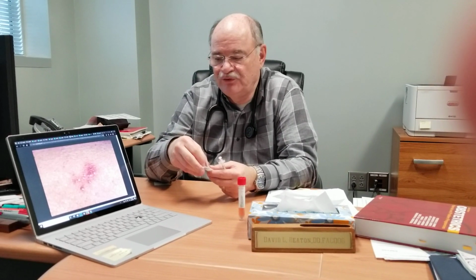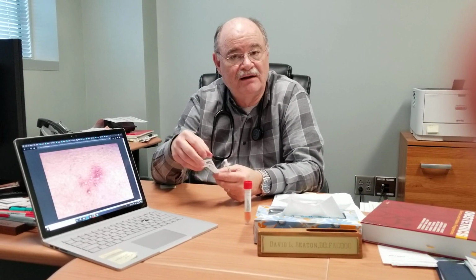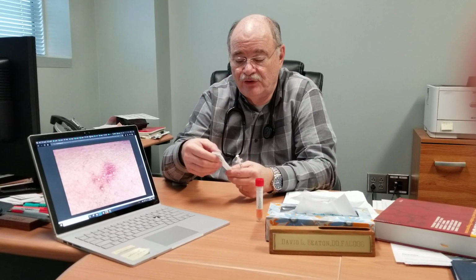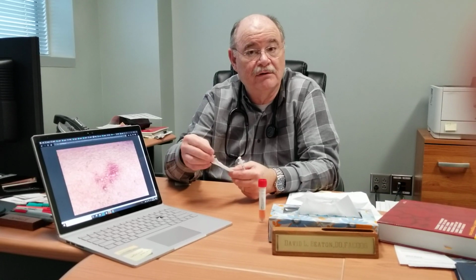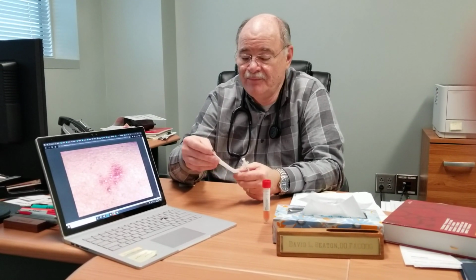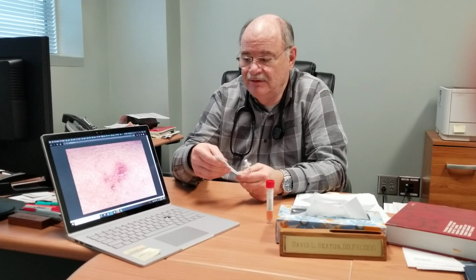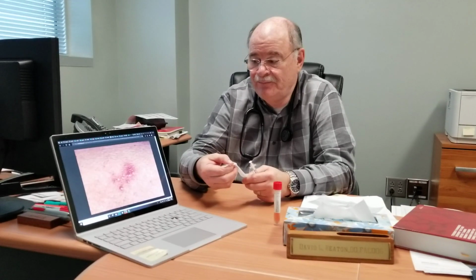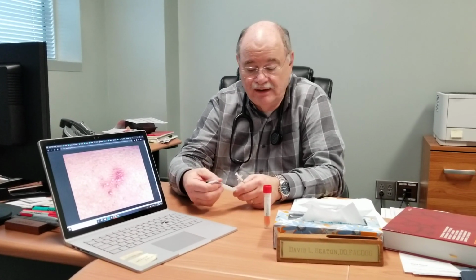I find that most patients find that very uncomfortable because the vesicles are quite sensitive and it's tender around them. So you're lucky if they don't kick you or bite you or not like you anymore. I have a different technique to get the sample, and it actually is less discomforting, and it actually is more liable to give you the proper diagnosis.